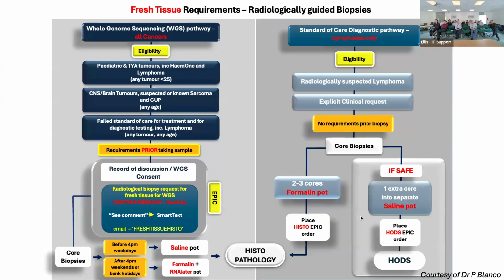So as Jim said, we have put together a visual, because I'm a morphologist, as you are as well, I assume. I like pictures and I like things to be there when I need them rather than reading through lots of pages. And I really would like you to send us any feedback via Ed or directly about it. It's literally just a summary of where fresh tissue is useful, how much you need, what needs to be in place for that to go ahead, and where flow should go up.